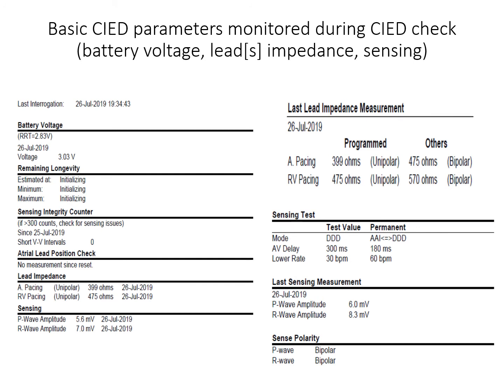Other basic parameters assessed during maintenance of cardiovascular implantable electronic devices include battery status, detection of signals from individual chamber or chambers, so-called sensing, impedance of the lead or leads, as well as pacing thresholds in individual chambers or chamber in the case of a single chamber device.